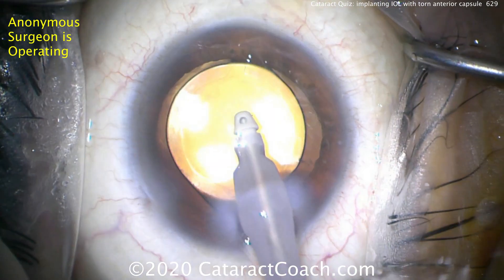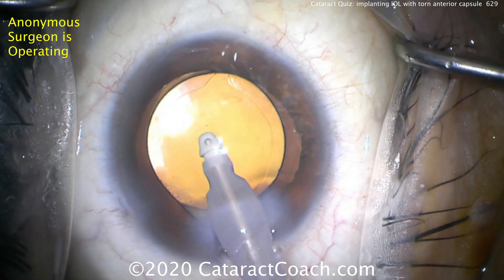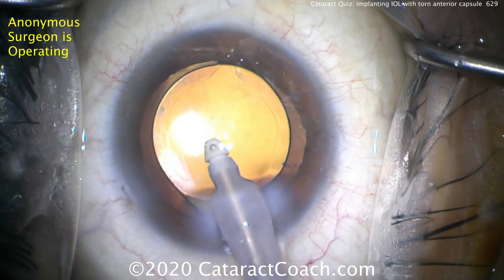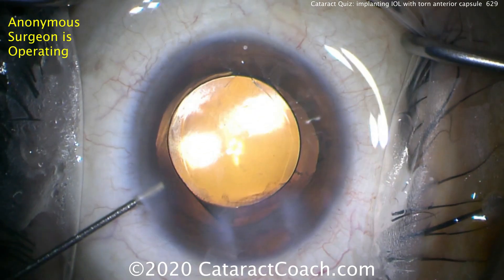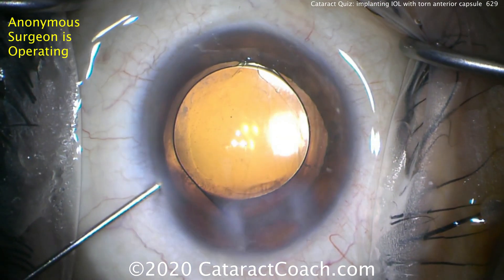Nicely and gently removing viscoelastic from the eye. Notice we did not go behind the optic — don't try to do too much, leave it be. Before you come out with the IA probe, inject balanced salt solution with the other hand so the anterior chamber stays formed. Don't let the anterior chamber collapse or shallow.